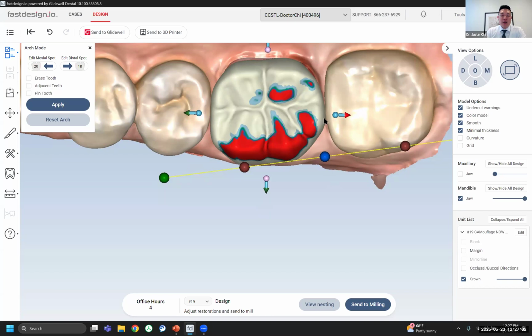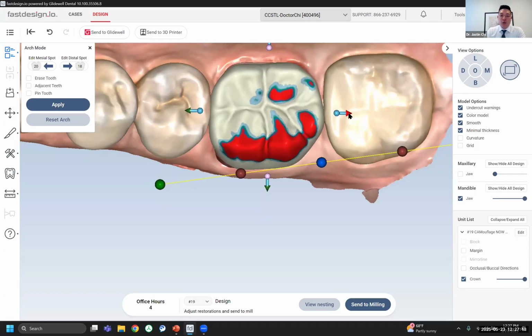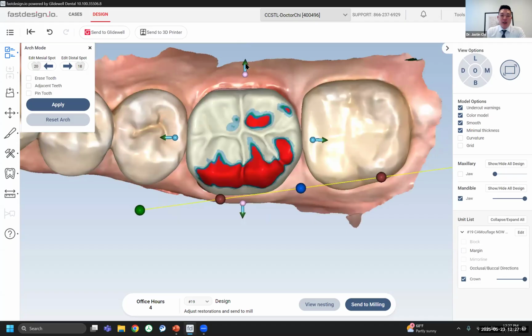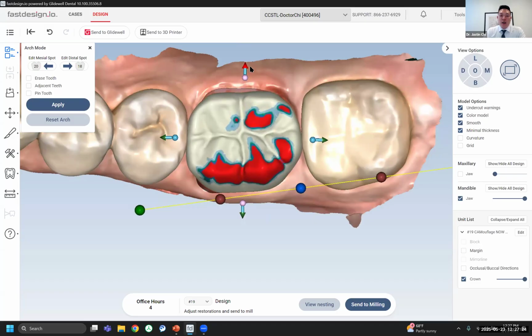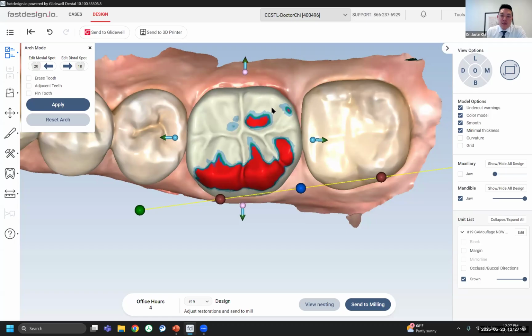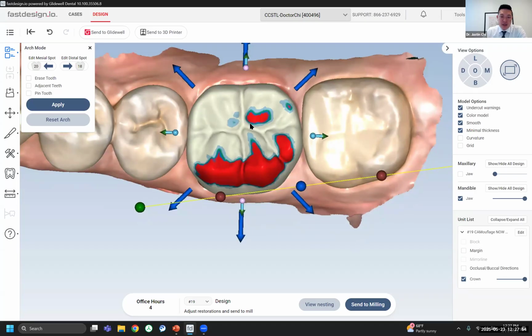So you basically want to size the tooth to the ideal size of this restorative site. So we have our mesial distal limits, right? We know how wide this is supposed to be. So we basically just widen it until we bump into the adjacent teeth. Buccolingually, we have the margins as a point of reference. So usually we're going to go to about where the margins are. And it's okay if you see the margins kind of hidden, because usually at that depth the circumference of the tooth is smaller than the coronal portion. So usually the whole crown will cover it. Seeing that the crown covers the whole prep is about where we would want that to be. And so we get it to the right mesial distal buccolingual proportion. So the size is basically dialed in.